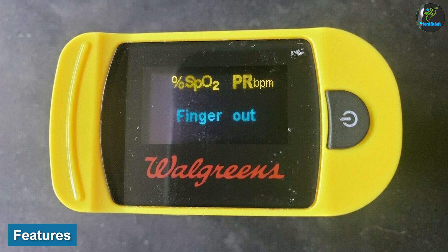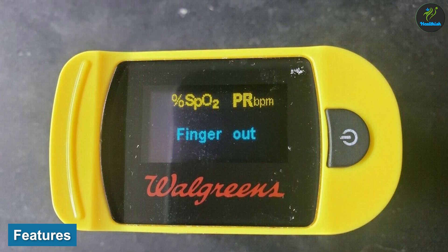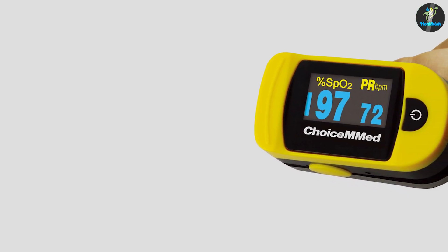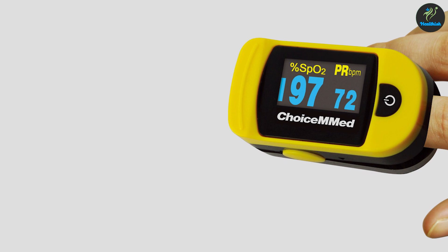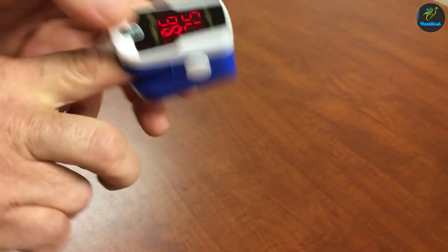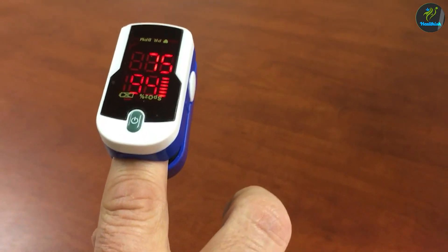Features of the fingertip pulse oximeter: a large display screen clearly displays SpO2, pulse rate, and pulse bar. Soft silicone padding and slip-resistance clip provide a comfortable fit. Easy operation with the push of a single button. An OLED 4-way display screen with adjustable brightness can be viewed from all sides. The pulse bar graph indicates the intensity of the pulse signal.